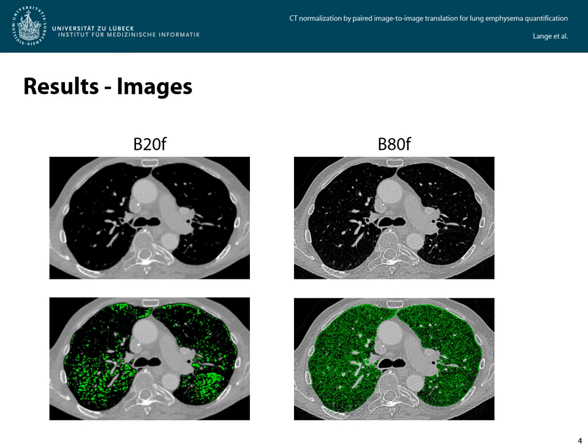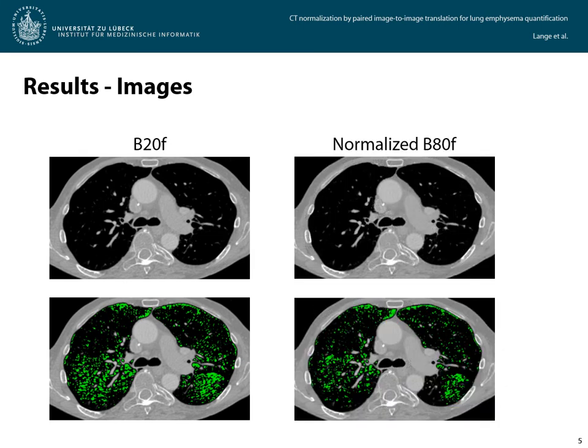Now coming to the results. In the upper row, you can see a paired test image slice of B80F before normalization, next to the corresponding B20F image slice, and below the emphysema segmentations. The normalized B80F image slice shows a much higher agreement in image impression as well as segmentation with the B20F image slice.